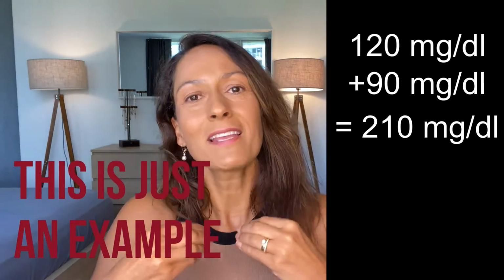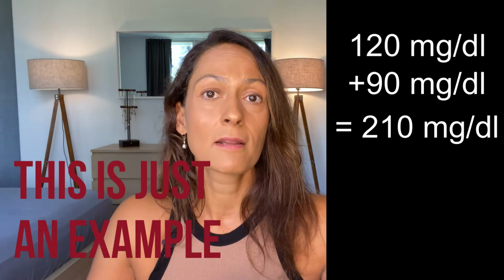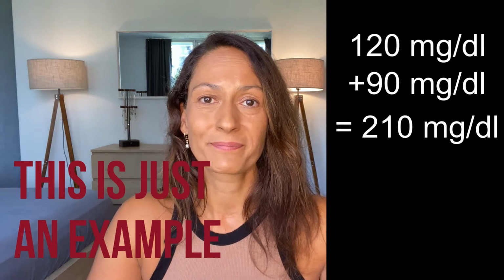So that's 120, which is my current blood sugar, plus 90, that's 210 milligrams per deciliter. So that is way higher than where I like to have my blood sugars. I like to stay below 160 milligrams per deciliter. So for me, I'm not saying that you have to do this, but for me, that would mean that I would do a correction based off of a 210 milligrams per deciliter blood sugar.